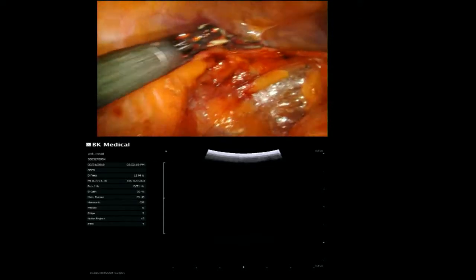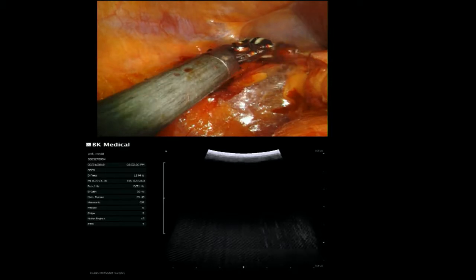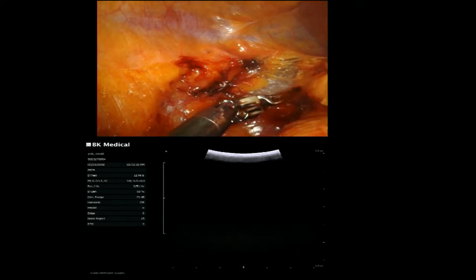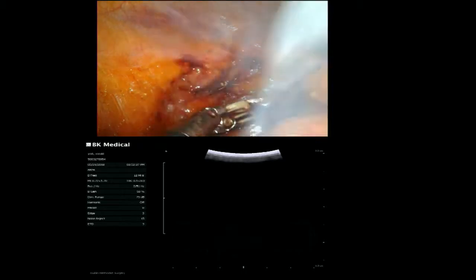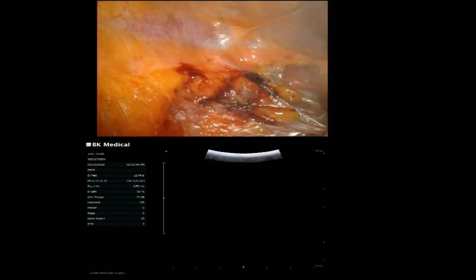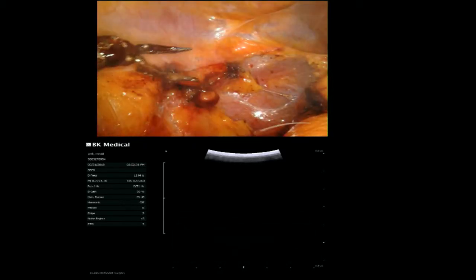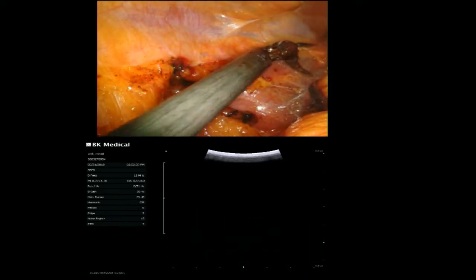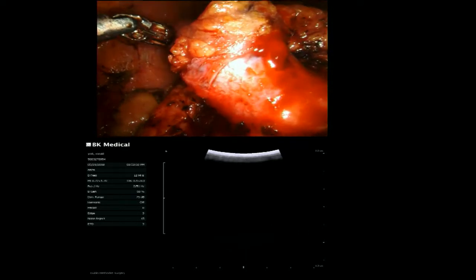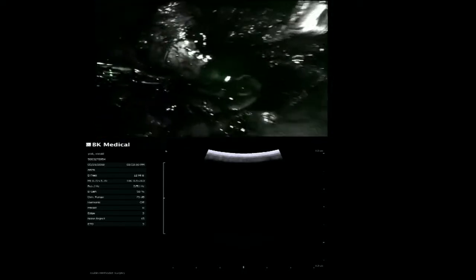I think as academicians, the pendulum has tilted a little bit too far towards saving every little nephron, whereas in the vast majority of patients, you just do a partial nephrectomy. Whether it's a 5 millimeter margin or 3 millimeter margin, if it's a negative margin, the patient's happy. But to risk a positive margin to save an extra 1 millimeter of kidney, I don't think that's the best thing to do. If you're an academician being held to a very high standard, like at Cleveland Clinic, where they're comparing you with Stephen Campbell's data, then you may feel the pressure to save every little tiny nephron. But that's not my goal when I do an elective partial like this on a patient with a normal contralateral kidney. A 5 millimeter versus a 3 millimeter margin is not going to make a difference to this guy for the rest of his life.